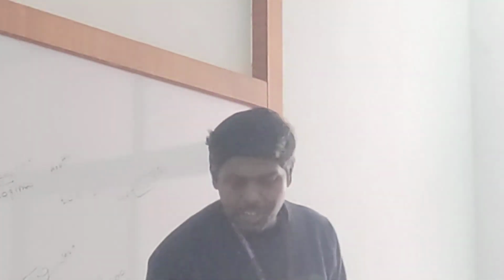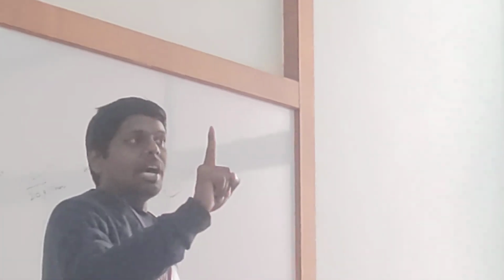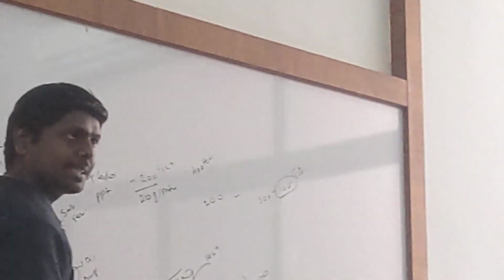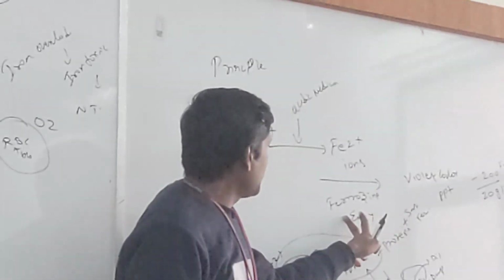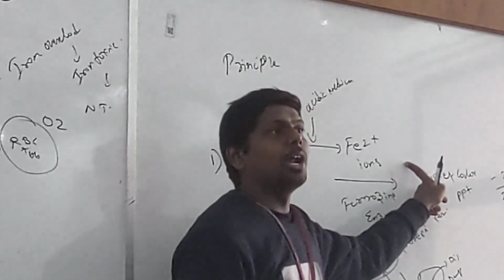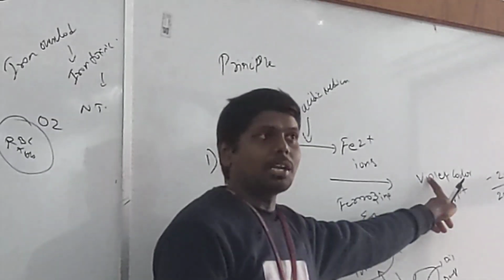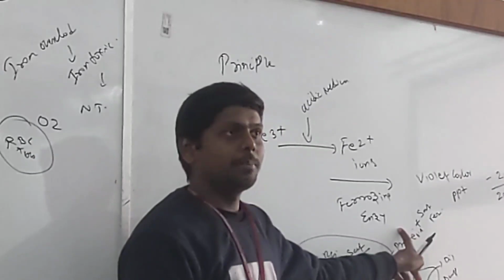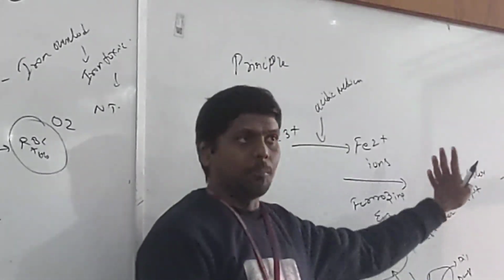We are measuring the protein's total binding capacity. That is protein under stress. So first, I checked whether Mukta can lift a weight or not with the normal iron test. I came to know in the normal iron test, this much protein has carried this much iron molecules. So there is protein involvement. That's why we got an OD value. We got an absorbance because there is a functional protein in the body. Mukta is lifting weight, that is, he is transferring some molecules.